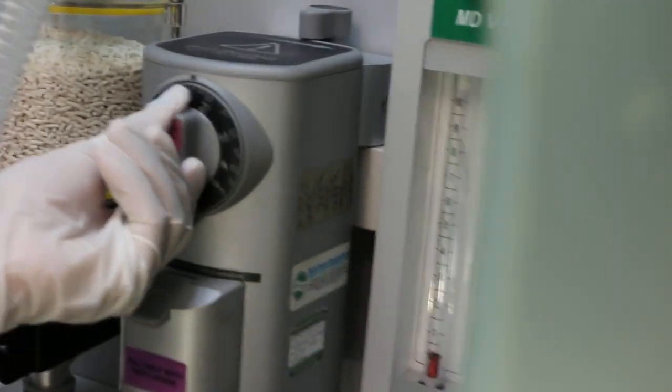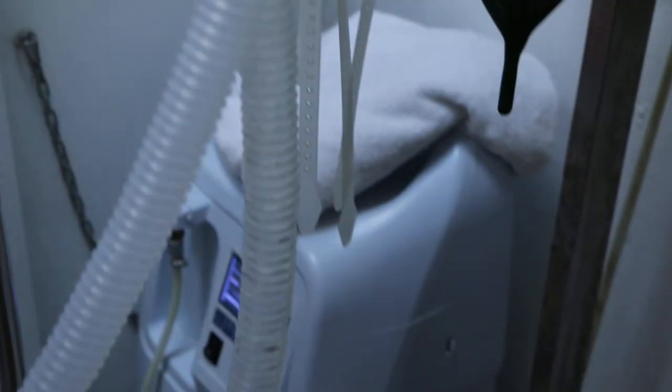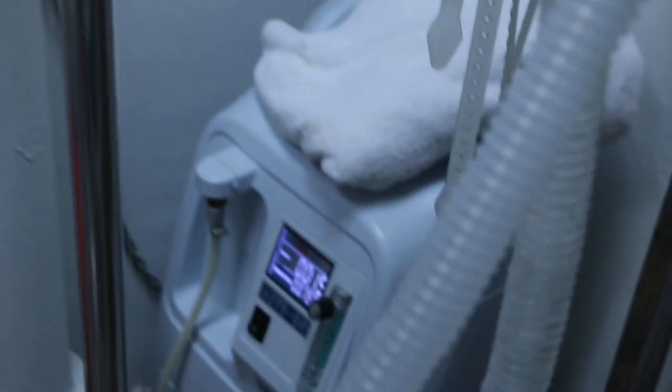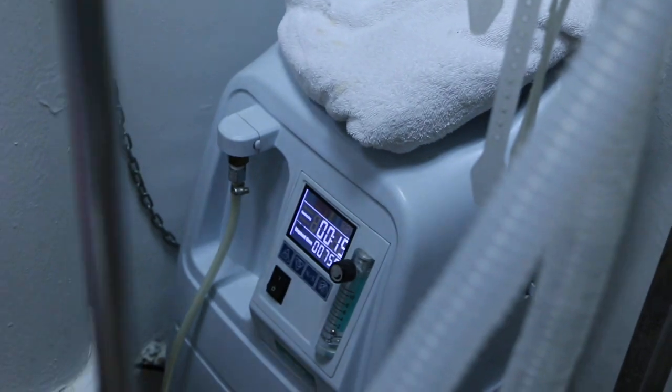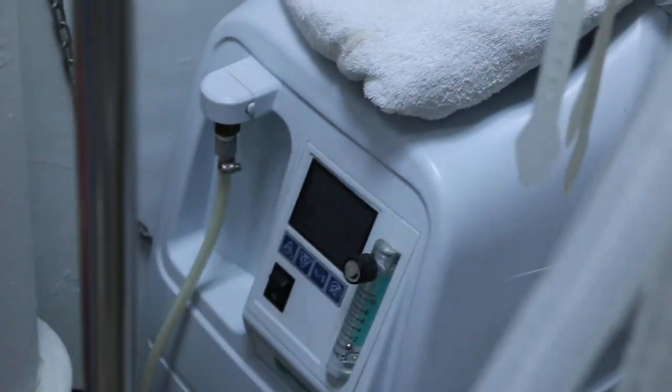That's it. Finish off. Zero. Oxygen generator off. How many minutes? Four minutes.